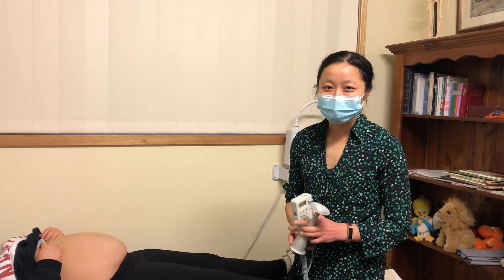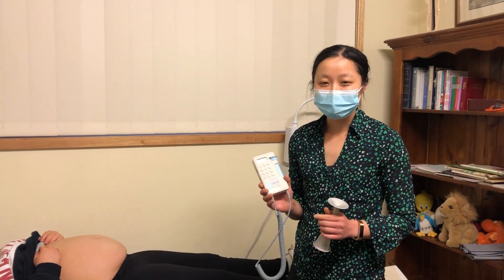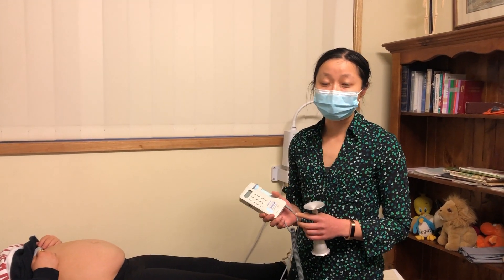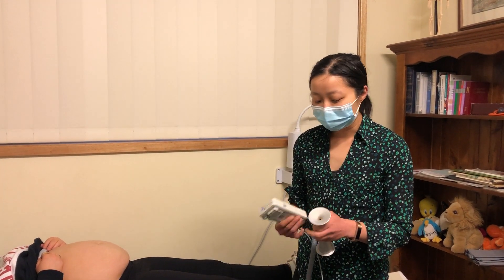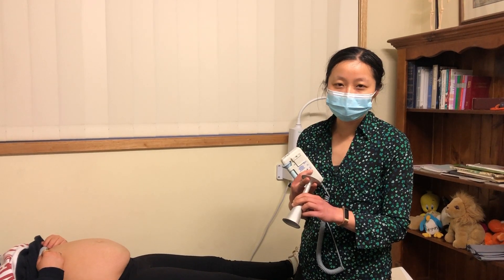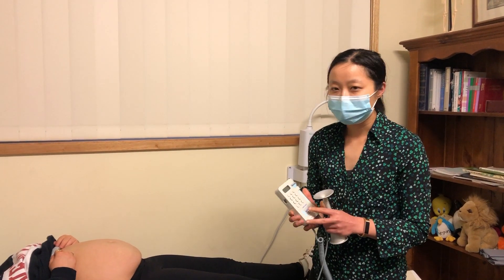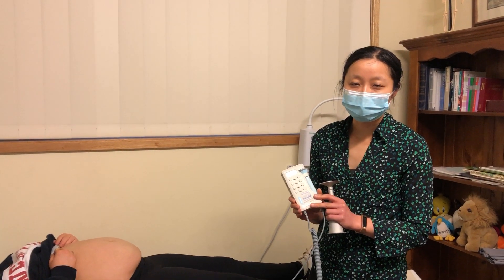I'm going to demonstrate the use of the Pinnard stethoscope and the fetal Doppler, which is a useful skill to have when looking after pregnant women antenatally or potentially intrapartum as well. The Pinnard stethoscope allows you to hear directly the fetal sounds transduced through the maternal abdomen, while the fetal Doppler uses ultrasound technology to pick up the sounds of the fetal heart.